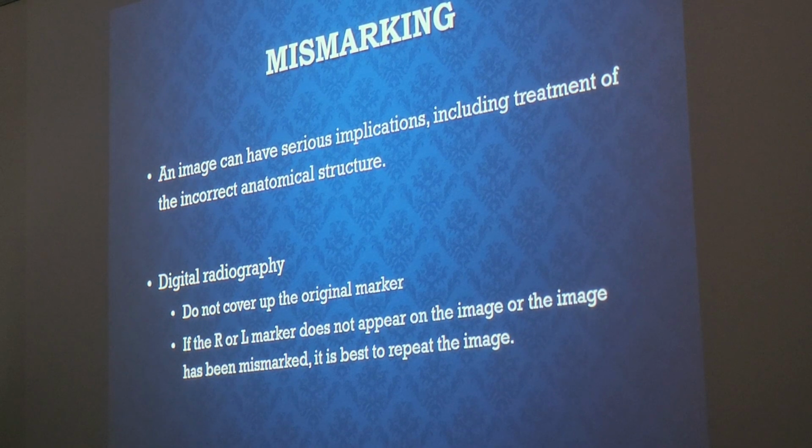For example, there have been many cases where anatomy was mismarked and that led to the patient having surgery on the wrong anatomy. You don't want that to happen to you. I mismarked an image once and I learned my lesson. I took a skull X-ray and got super confused, mismarked it, and ended up being called out by the radiologist.